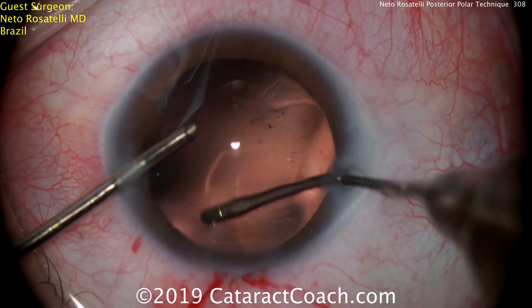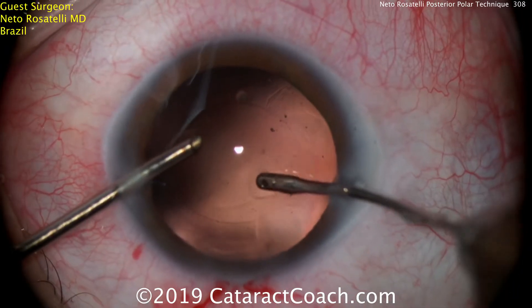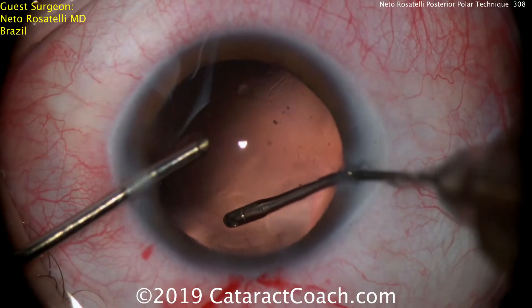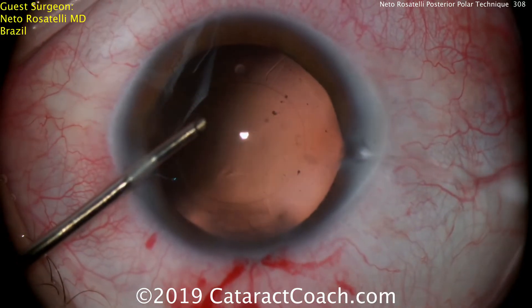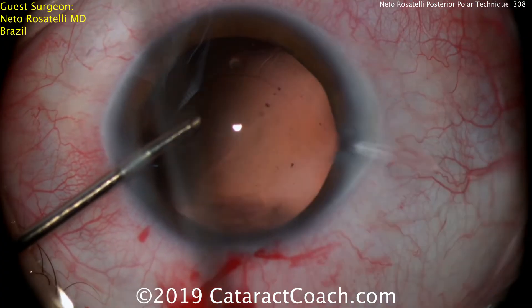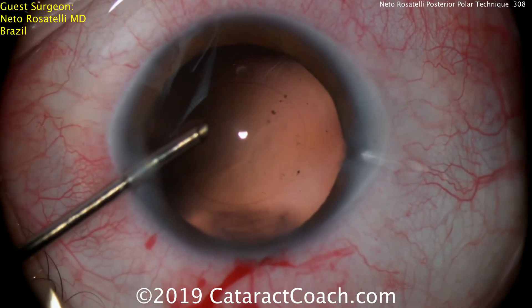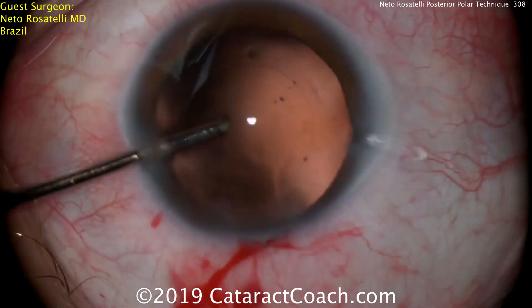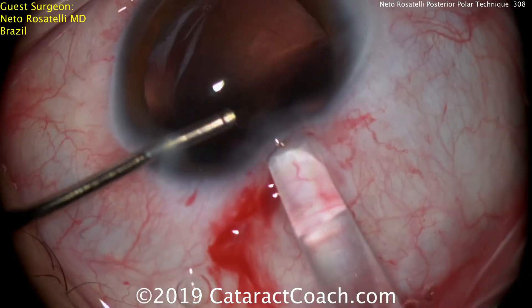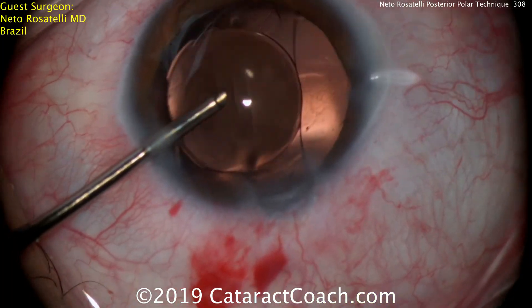That looks great — completely clean capsular bag, everything's still intact. And of course, this is a younger patient, so to have a great long-term outcome, it's always preferable to have the IOL well within the capsular bag. So the infusion is in the left hand, and now coming in the right hand, we're going to get our lens — it's going to be placed in the capsular bag. There's the injector with counter-traction, and the infusion being maintained with the left hand.